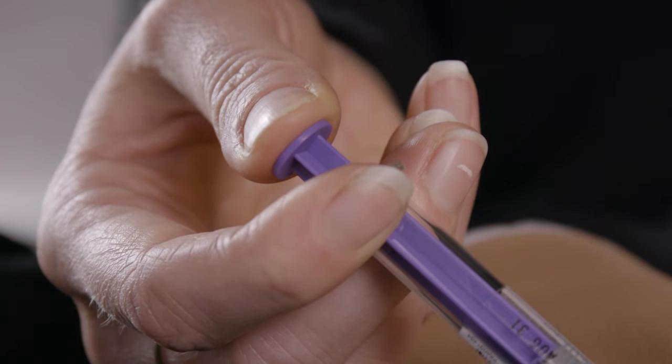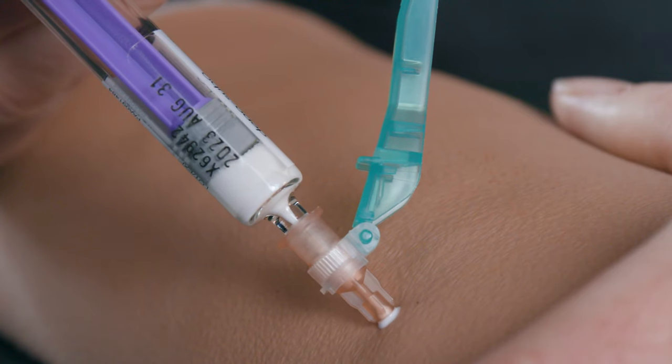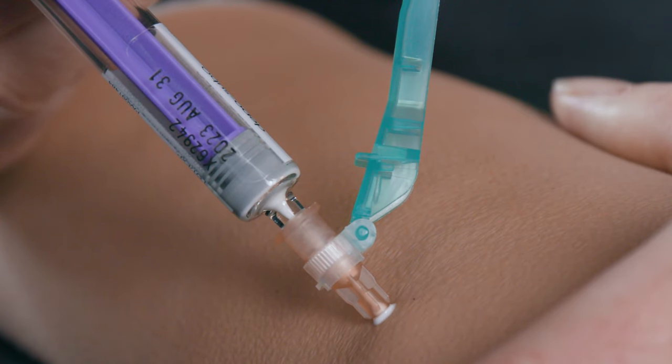Push the purple plunger slowly over five to seven seconds to inject the medication. Make sure that all the medication has been given before removing the needle.